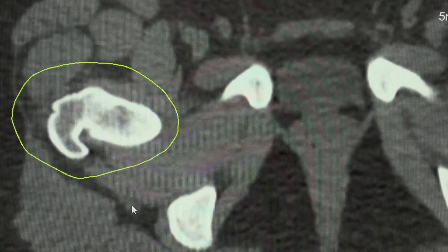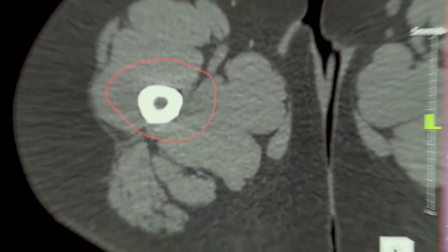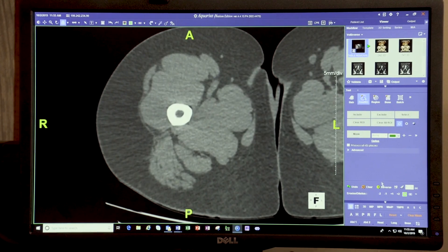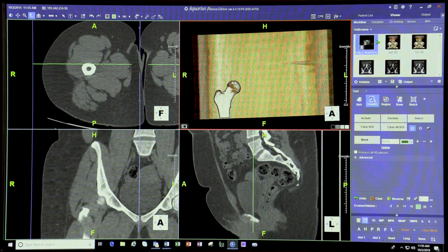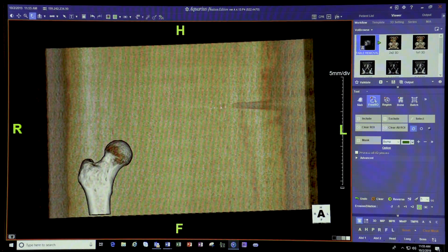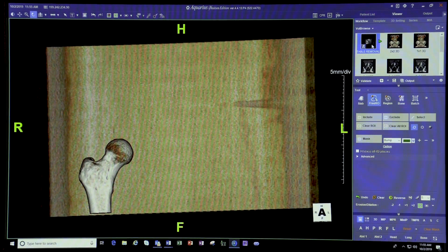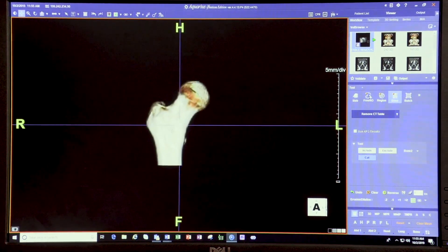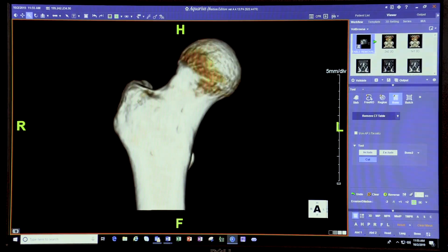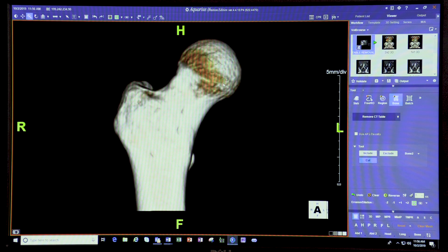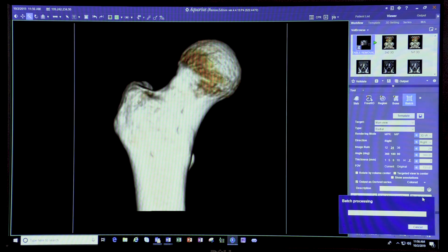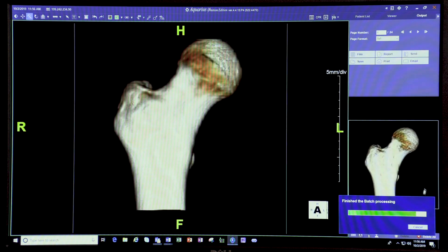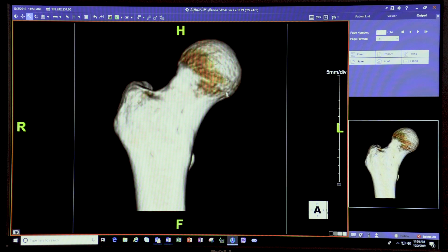Now the whole bone is inside — it interpolated the rest of the scans as I scroll all the way down. A critical step here is to press Exclude, which excludes this femur first — that's how Terra Recon works. Then you reverse it, and you'll see only the femur you outlined. There's a CT table visible in the background; clicking Table Removal takes it away. Now we have an individually segmented femur, and you can see the little bump on it. We rotate it the same way as the whole pelvis: go to Batch, go to Output, and it rotates side-to-side so the surgeon can see where to shave off the bump.